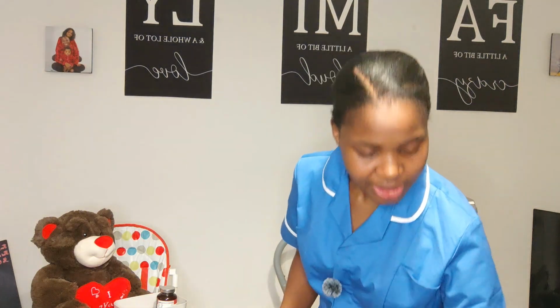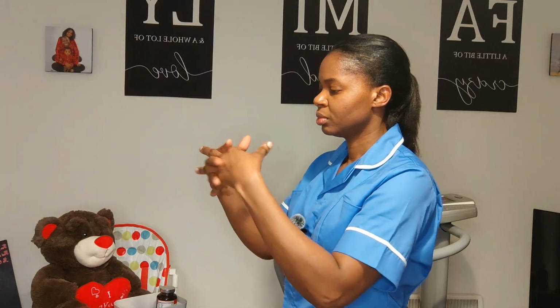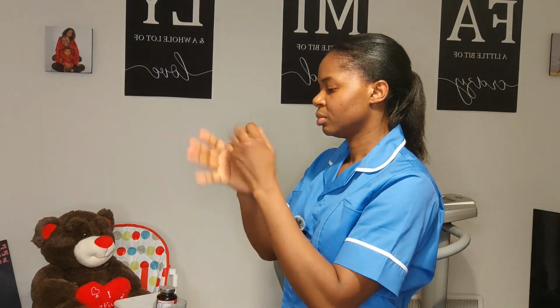Leaving my patient bedside, I'm going to perform my hand hygiene following the 7 steps of WHO standard. All right, assessor, could you please confirm my tray is clean and is ready for use? All right, thank you very much. I have on my hand salbutamol. It is not expired. The expiration date is February 2026. It is in date. I'll go ahead and compare that with my chart to be sure it is a correct prescription.